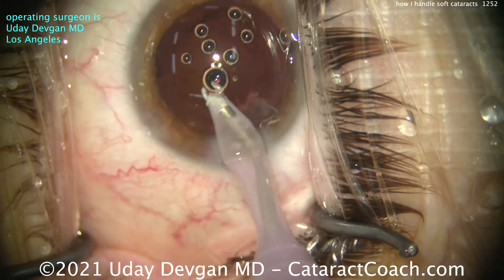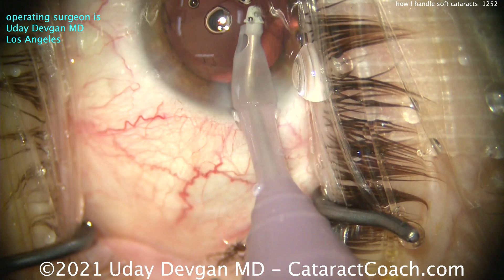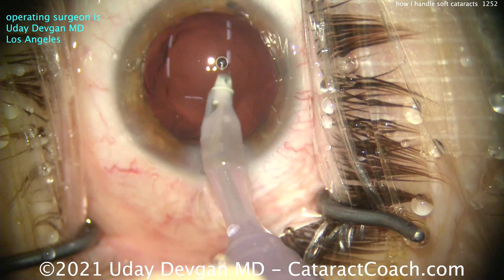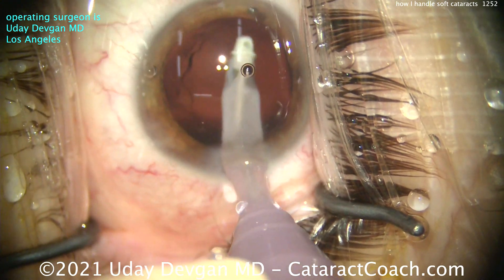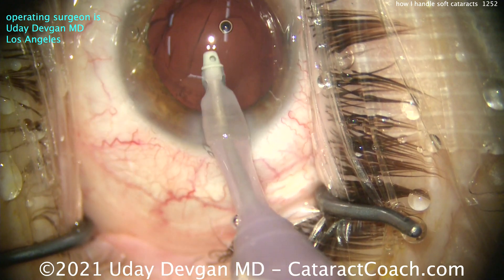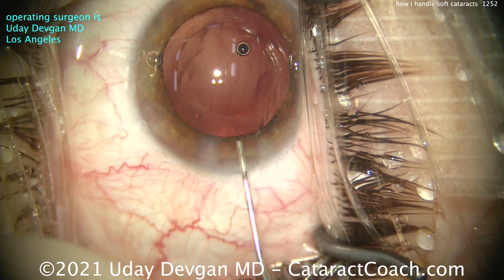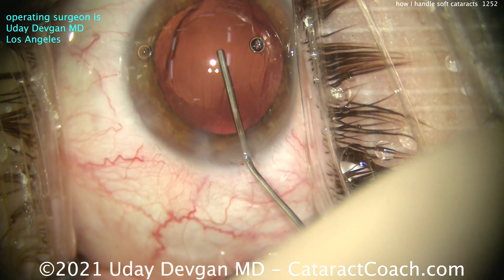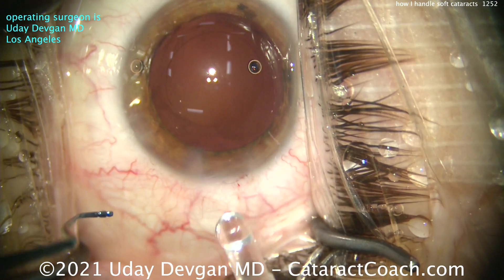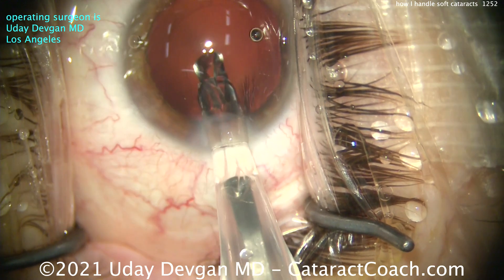We'll clean up all that cortex and do a beautiful job cleaning it up. Also keep in mind the YAG capsulotomy rate is much higher in a young person. For pediatric cases — for a newborn with a congenital cataract — the PCO is so intense that not only do you open up the posterior capsule, you even do an anterior vitrectomy. The same thing applies to other young kids having surgery. Yes, it diminishes when you're in your 20s or 30s, but your rate of PCO is still much higher. Keeping that in mind, we'll clean up the bag as much as we can, and in the post-op period, if the patient needs a YAG laser capsulotomy, we've got that covered — I have the YAG laser right here.